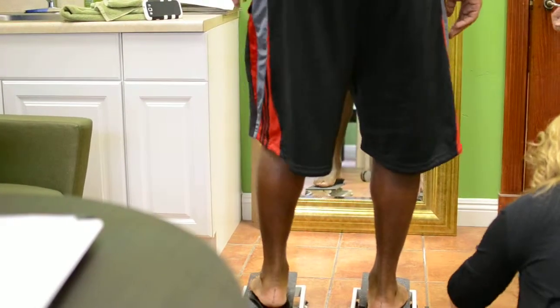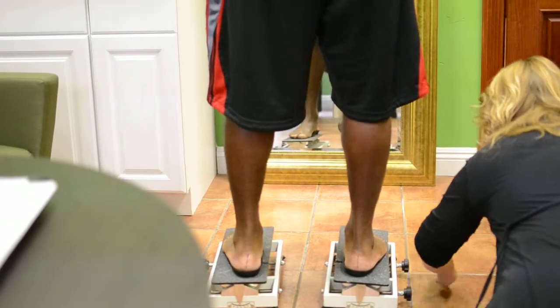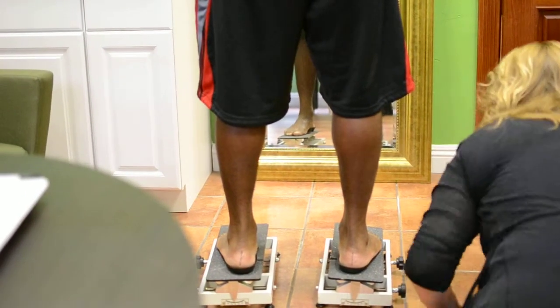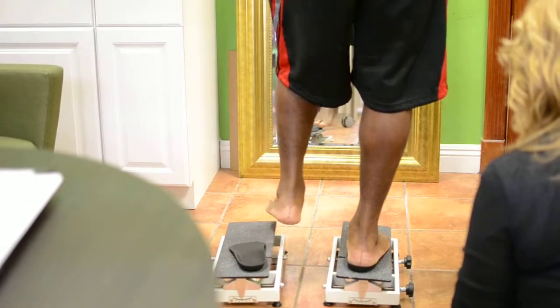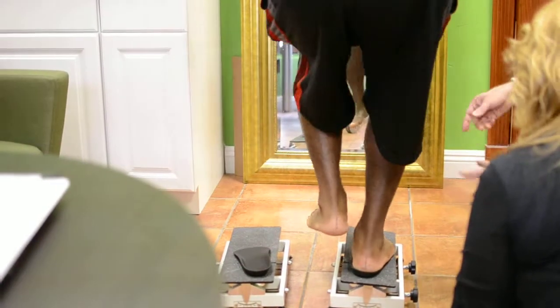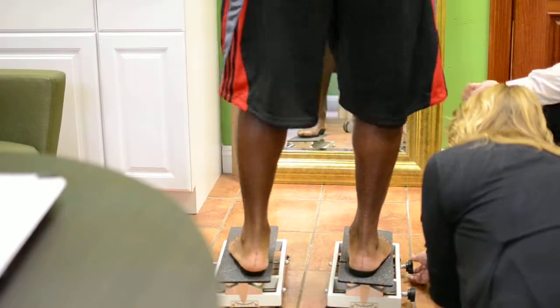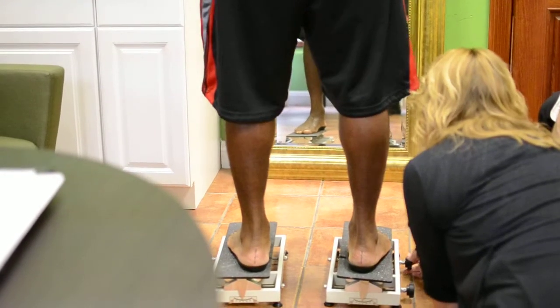That's at about five degrees of forefoot posting. I could take it down a couple of degrees and have him do it again to see if it's better or worse. Now his toes are fully coming up, so that's not enough correction. I've got to bring it back out.